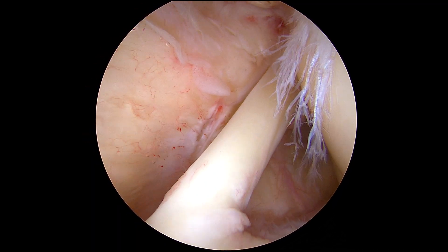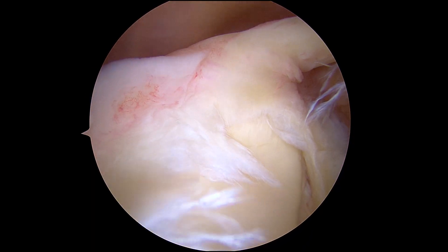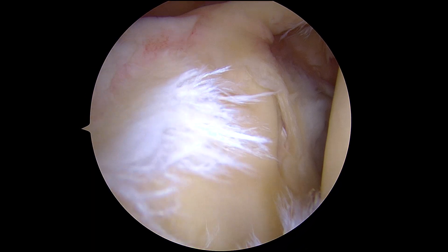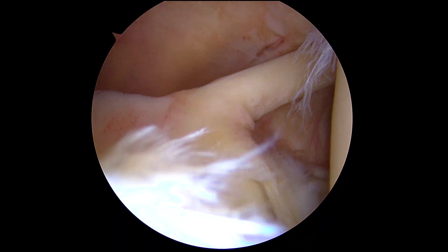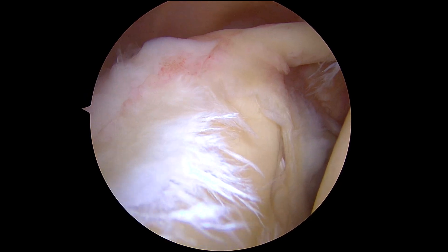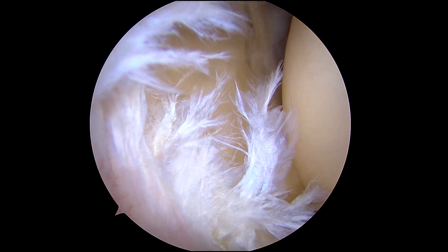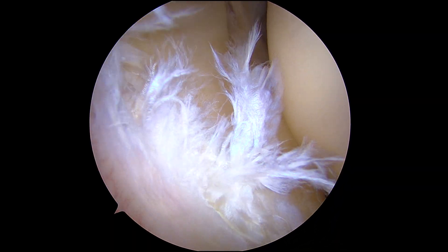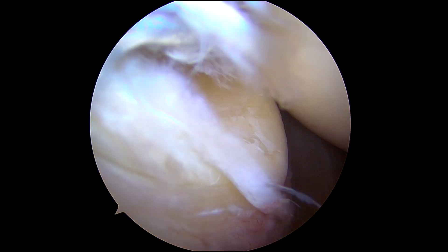Here is the long head of the biceps tendon which comes down and attaches here to the superior labrum. As you can see, that's not normal — she's got a superior labral tear which involves the bicipital labral anchor complex over there. So that's a SLAP tear, and then if you look down here this labral tear extends into the back.